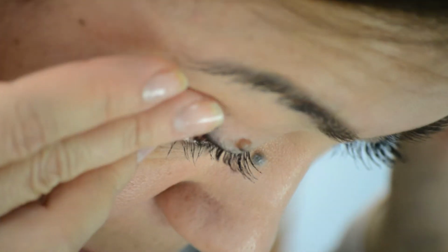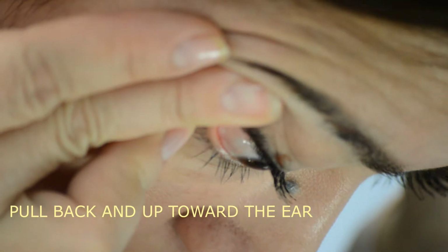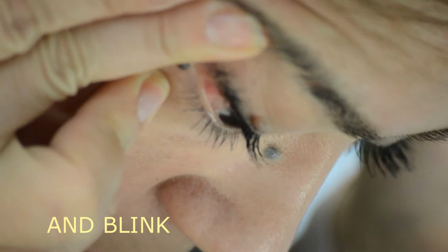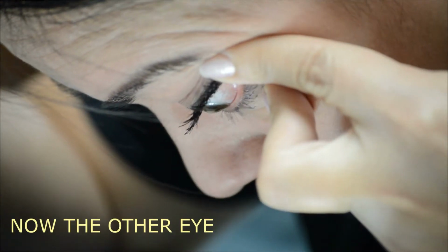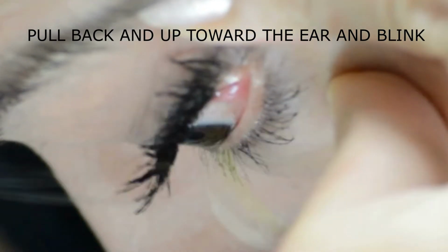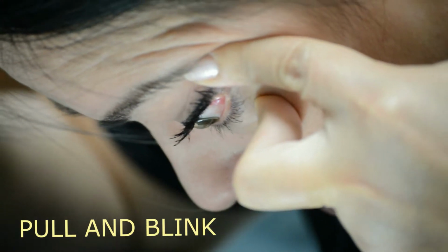Didn't quite get it this time? Let's try it again. Grab the corner of your eye, pull back and up toward the ear, and blink. See how it pops right out? Easy, right? Now let's do the other eye. Apply pressure in the corner of the eye, pull back and up, and blink. One last time. Pull back and up, and blink.